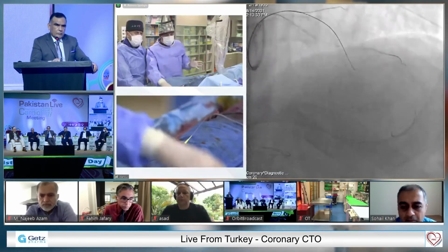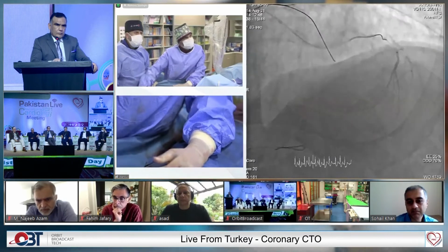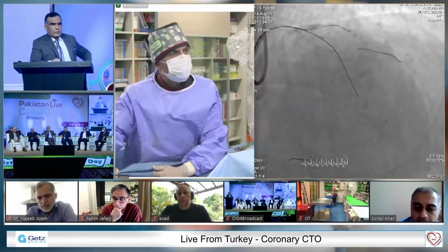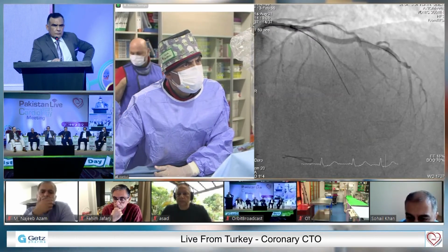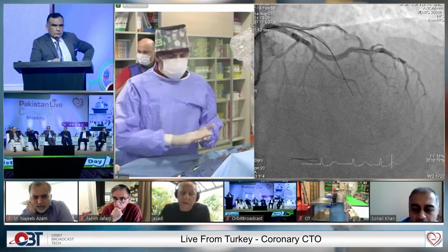So we have to see clearly where it is, because obviously my wire didn't go. Let's see. Not this, the other one. Okay, frame by frame. Maybe it comes from another branch. But it's from here, right? Do you see it now?